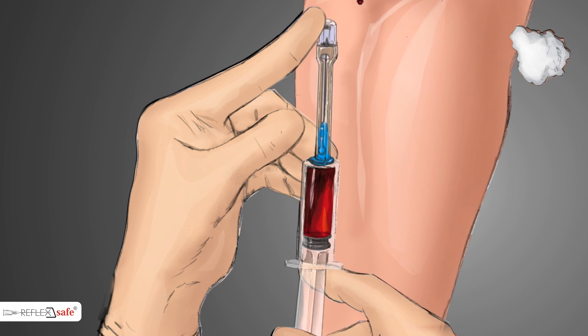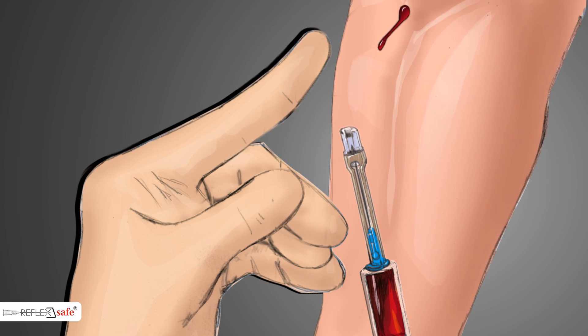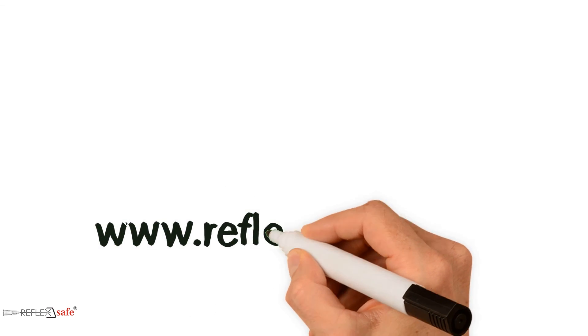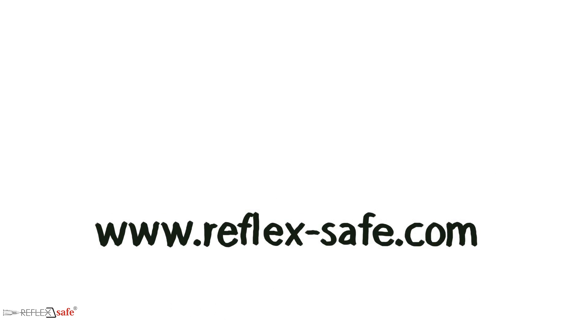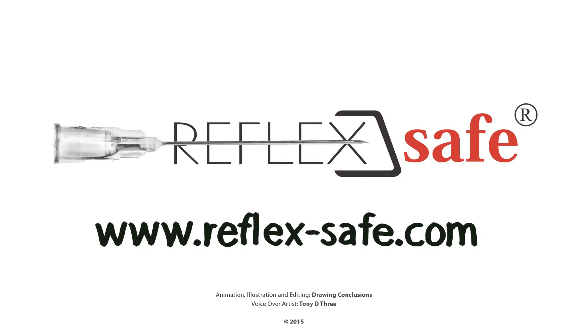Reflex Safe therefore offers a completely passive safety feature that protects where other products do not. For more information on this simple and cost-effective solution, contact your local agent or visit us at www.reflex-safe.com.